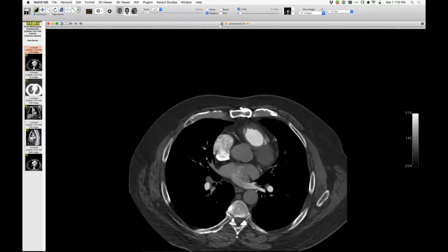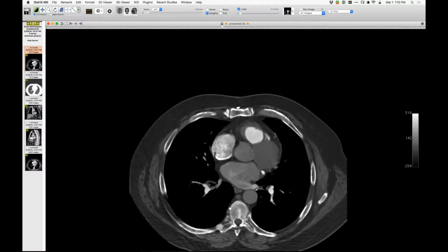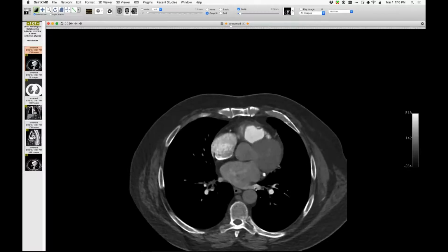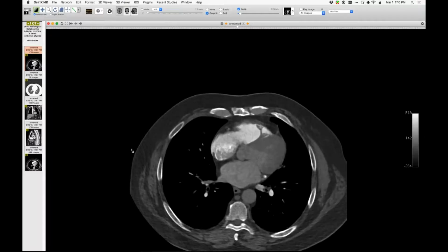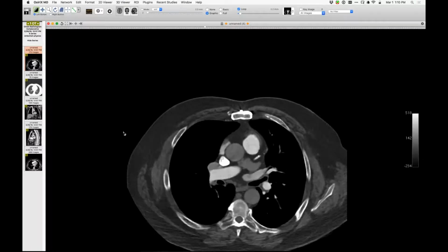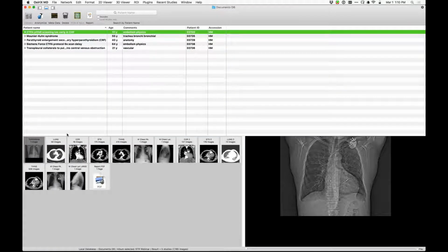So we use a bolus tracking procedure. We have a cursor on the pulmonary artery and a threshold of 100 Hounsfield units. Our default until now for the other scanners we have is 6 seconds, I think it is. So when you have very little margin for error, if you then scan another patient, like this patient, which we had the other day too.